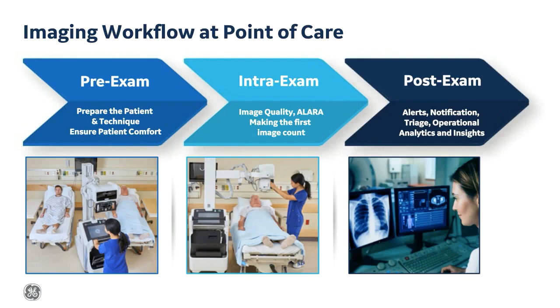In pre-exam, you may have a technologist who drives the equipment, be it an ultrasound or a mobile X-ray, at the bedside next to the patient. Now, that patient may be unconscious, and he or she positions the patient, for example, placing a detector, ready for the examination, selecting the right protocol. So all that is step one.